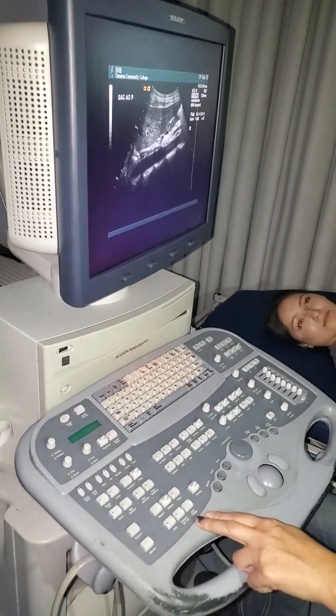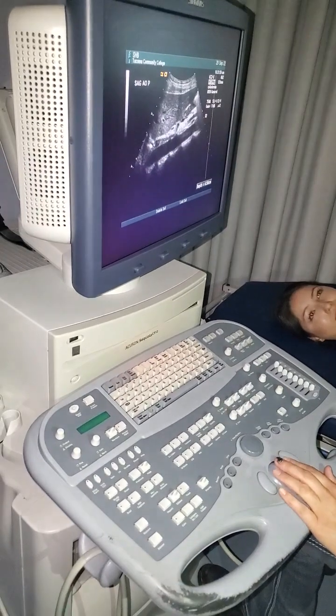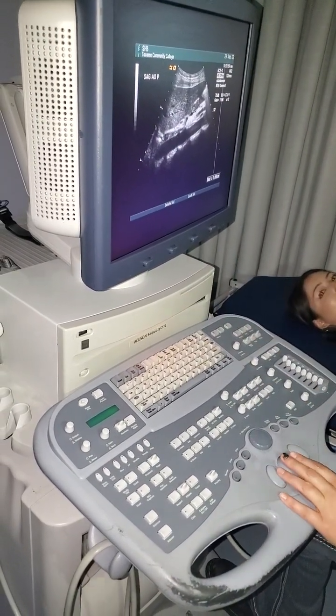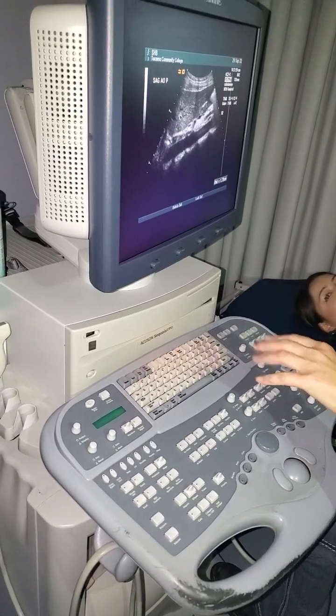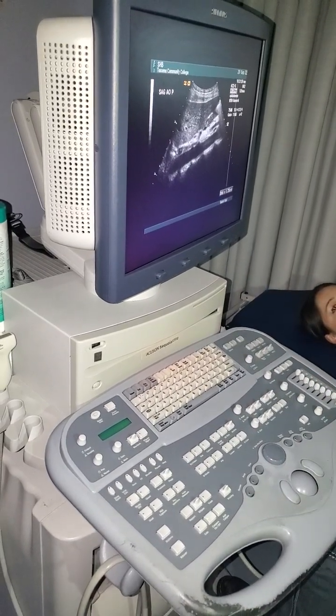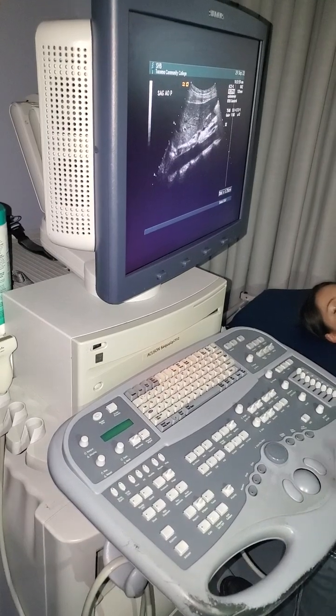So we also have things, we're gonna measure things. There's 2 buttons that do the same thing. I can do calipers on or off. It's gonna give me a caliper and I can cruise him around. I can set him with my side buttons, or I can lock set. If I were to print this image, it would look the same as if I push lock set. So I never do the lock set, I just print the image, I just save the image. If that makes sense. It doesn't matter, I mean, who cares?